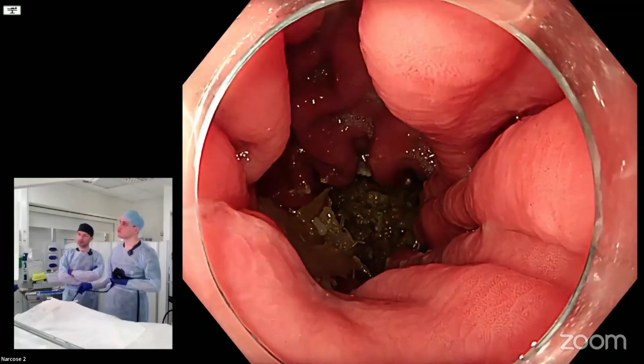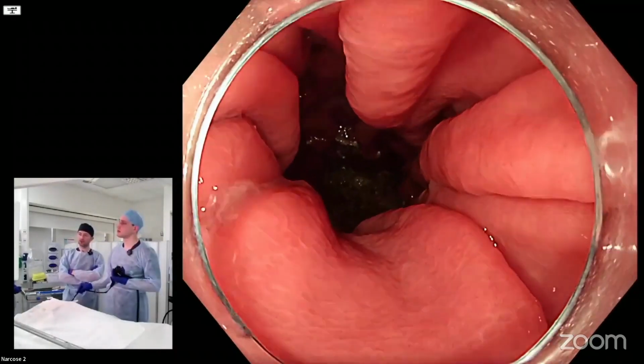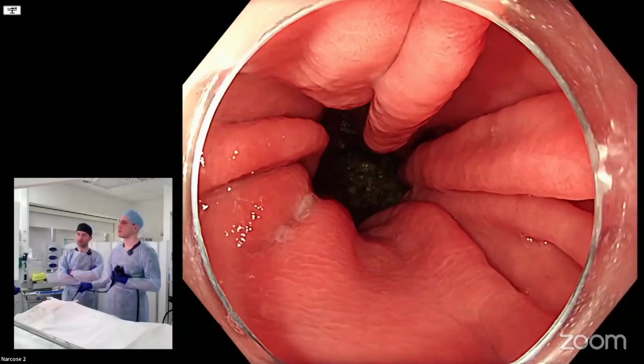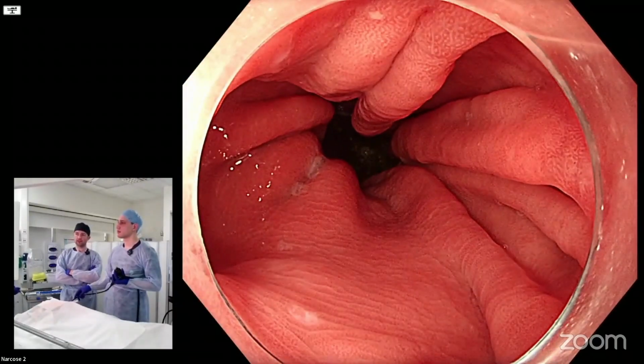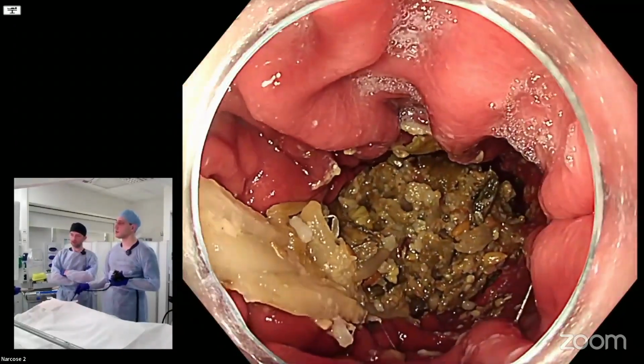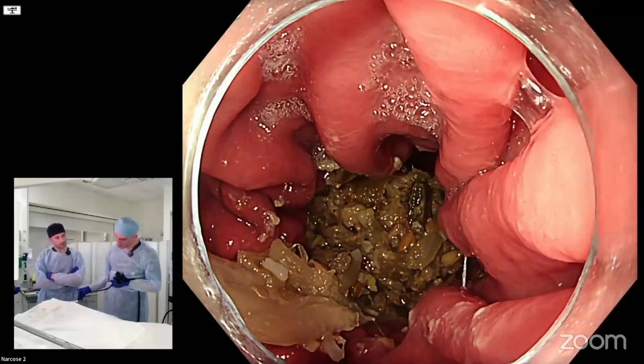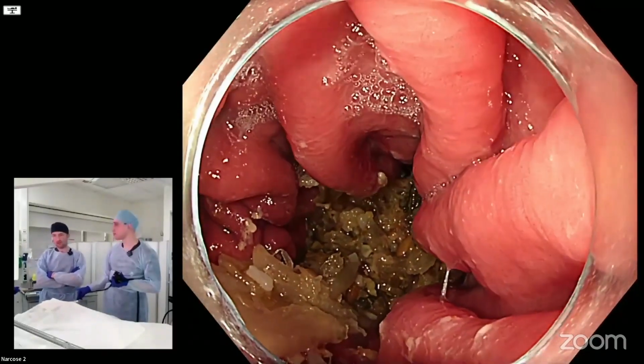Come back, come back. Okay, come back more. So we just get an overview, right? Come back more. Okay, so you can clearly see it in the distance, the diaphragmatic pinch, right? Now go in more. Now go into it where you think that it is. More, more, more. Stop. Okay, I think that's where it is. Okay, this distance is? I would say 39. 39 centimeters.